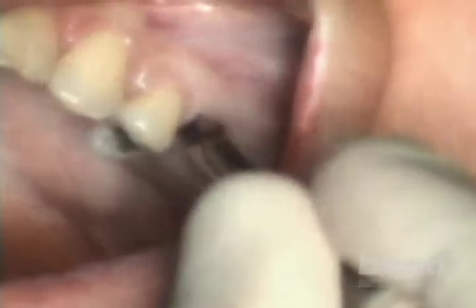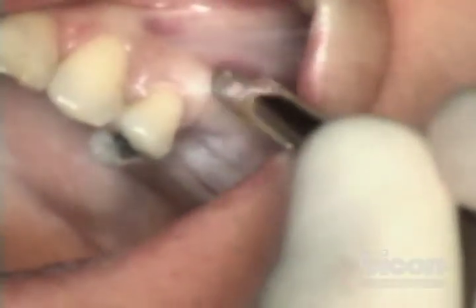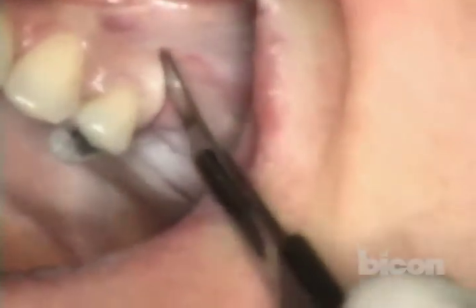I'm a big fan of doing curved incisions — they are easier to suture. Dr. Nisparati next to me is noting my head is in the picture — I always bring it back. Okay, the incision is made. Let me have the small mirror.